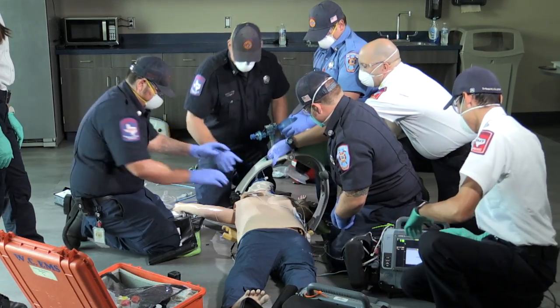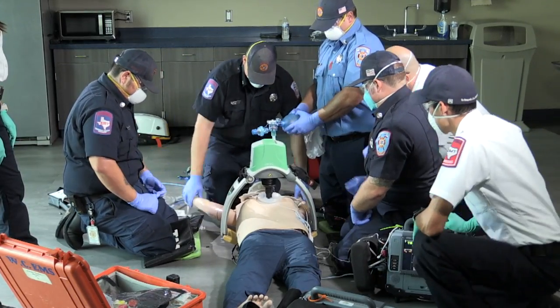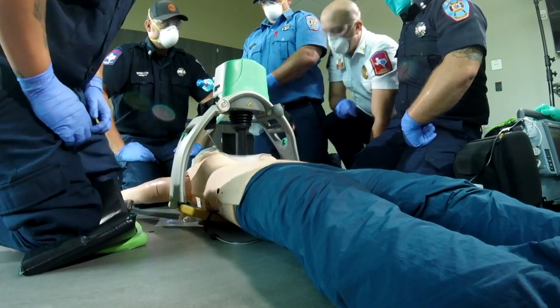Go ahead and attach the Lucas, guys. Connect my side. All right, are we good? Secure. All right. I'm going to mark it. Watch the migration. All right. I'm going to get the straps.